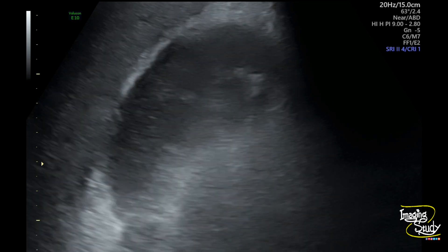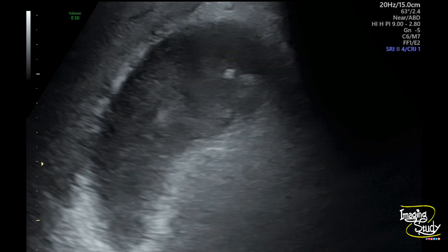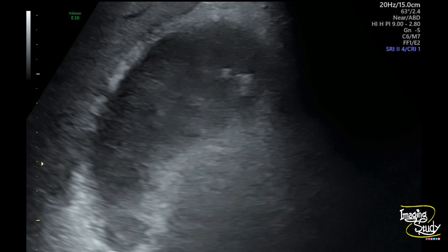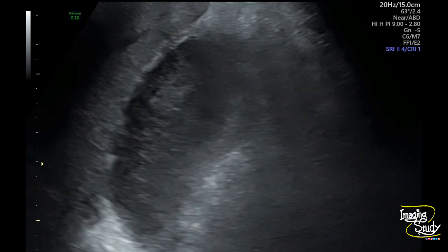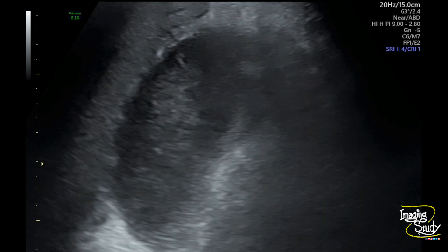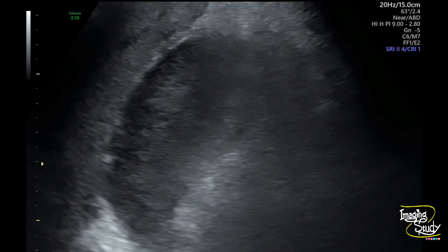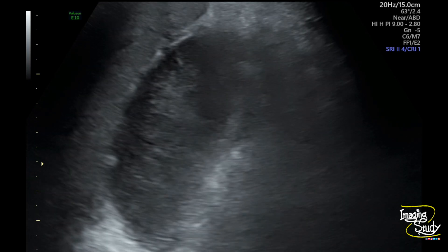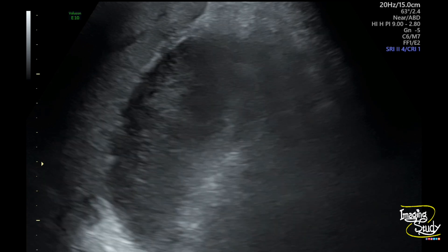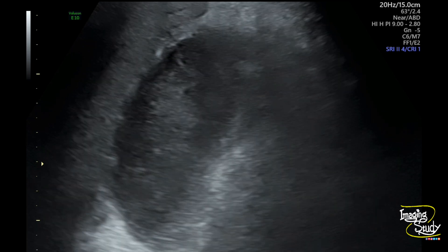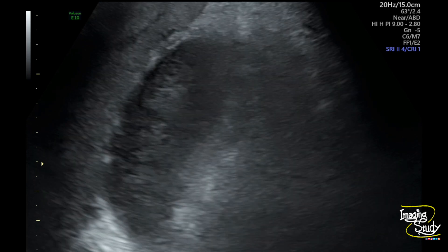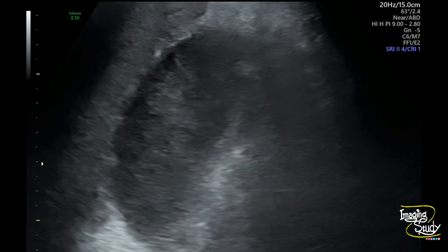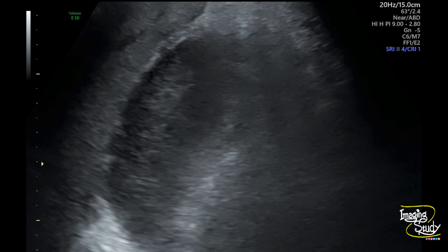This streaming doesn't happen for biliary sludge because sludge is a thick component and after changing posture it takes time to move along gravity. But here you can see it's moving. This suggests that the moving particles are not sludge — rather, they are pus.